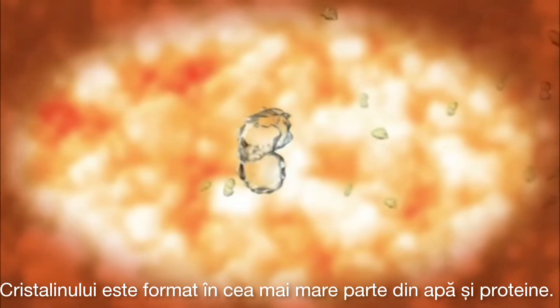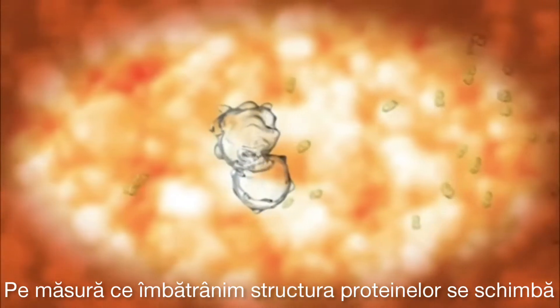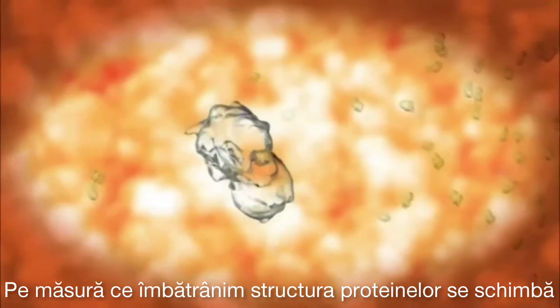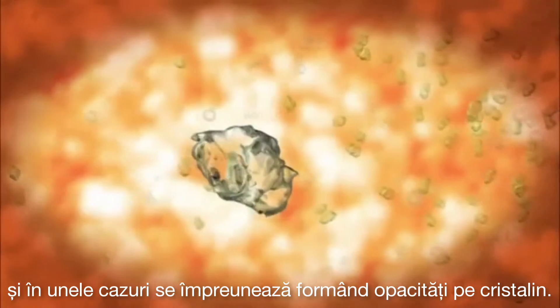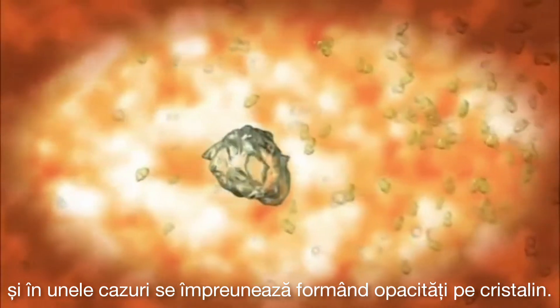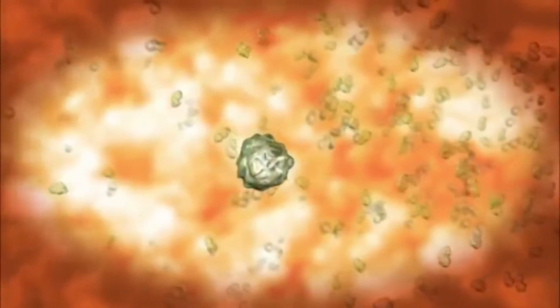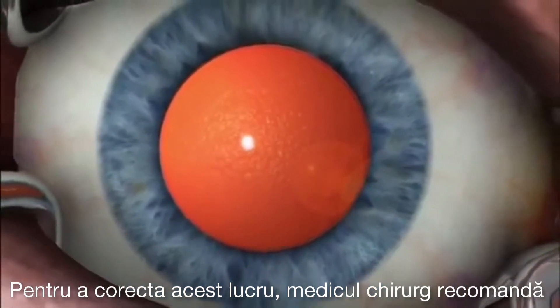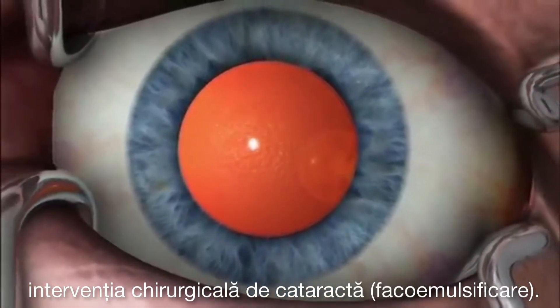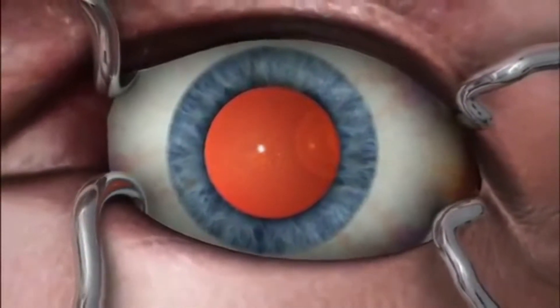The lens is mostly made up of water and protein. As we age, these proteins change and may begin to clump together, obscuring portions of the lens. To correct this, a doctor may recommend phacoemulsification cataract surgery.